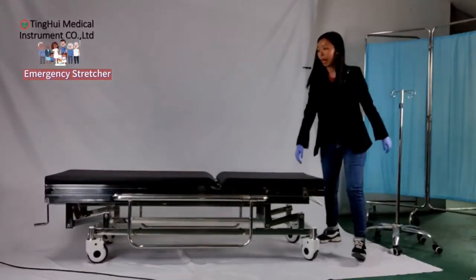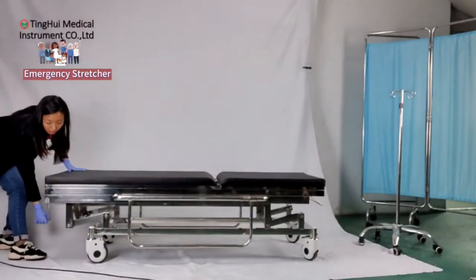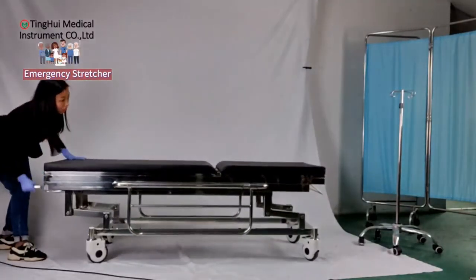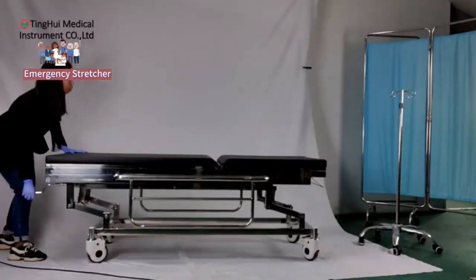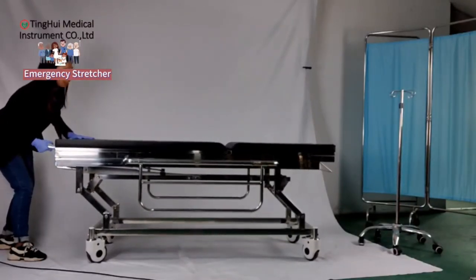It has a function to adjust the height when transferring the patient to the surgery room. You can use this panel to make it low or high, and that would take maybe 20 to 50 seconds.